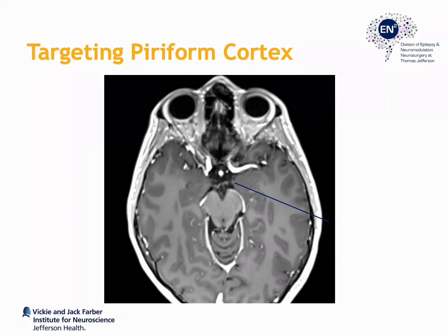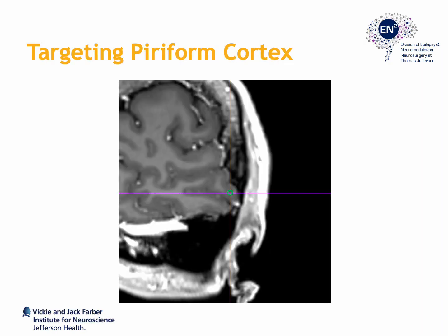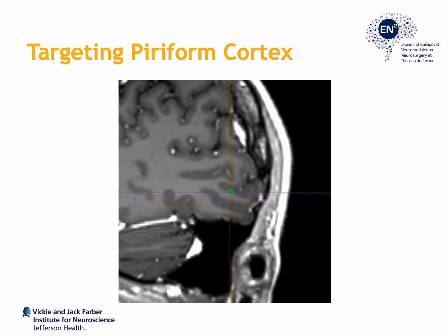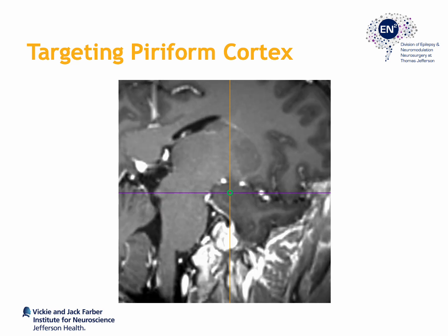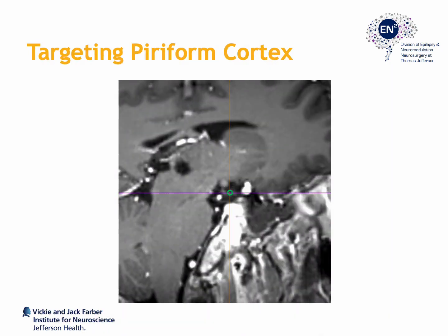In order to plan the rest of the trajectory, an entry point at the crest of a gyrus is determined. Given the orientation of gyral and sulcal anatomy in this portion of the brain, this entry point is typically found in the temporal lobe in the region just above the external auditory meatus. Once the entry point has been defined, the target is extended to the most medial aspect of the uncus. The resulting trajectory enters the middle temporal gyrus, traverses the temporal stem, goes above the temporal horn, enters the amygdala, and ultimately terminates at the most mesial portion of the uncus.